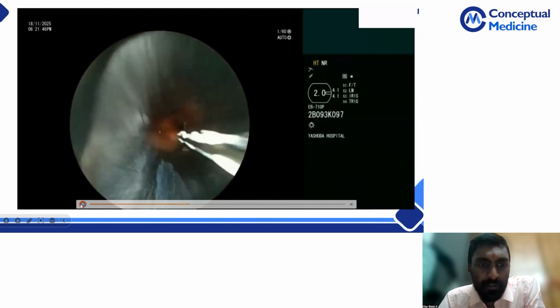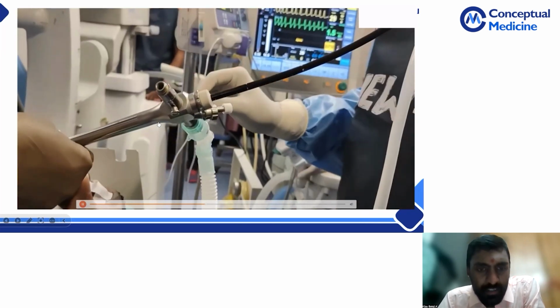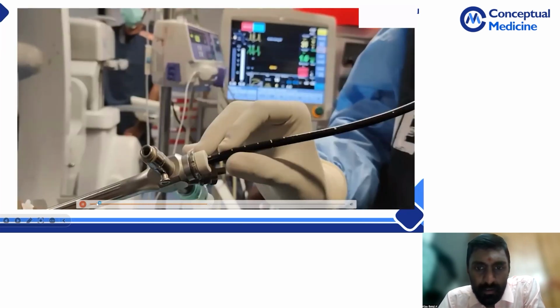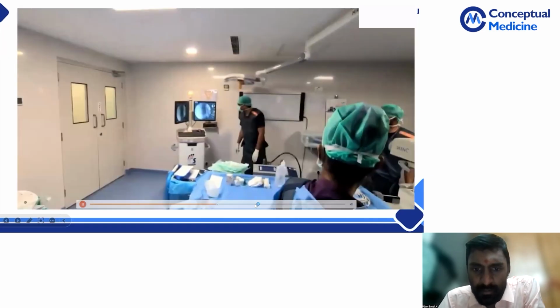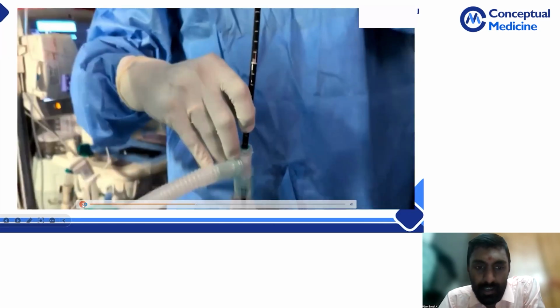So this is a rigid bronchoscope. You're seeing this is a metal barrel. This is a normal bronchoscope, the rigid bronchoscope barrel. Okay. So I'll show you parts of that also in case they ask you. Maybe in your Viva, if you're appearing for pulmonology, they'll definitely ask you.